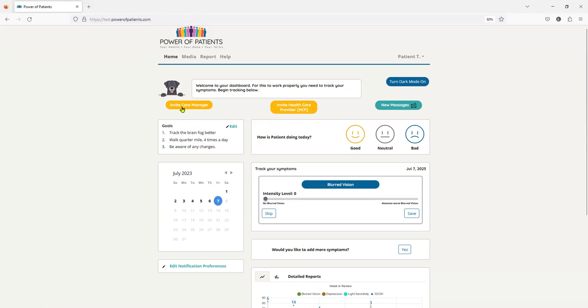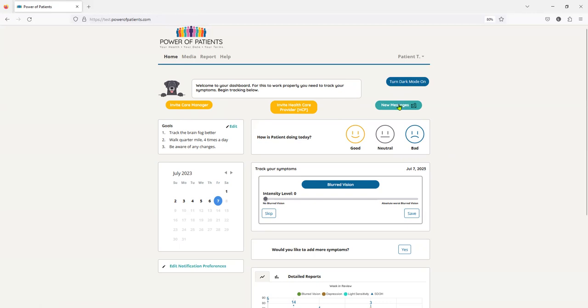This is where you're going to invite the care manager, invite a healthcare provider, and any messages. If it's red, you don't have any, it's green. So that means I have some messages. So before I start tracking, I'm going to just show you how easy it is to track.